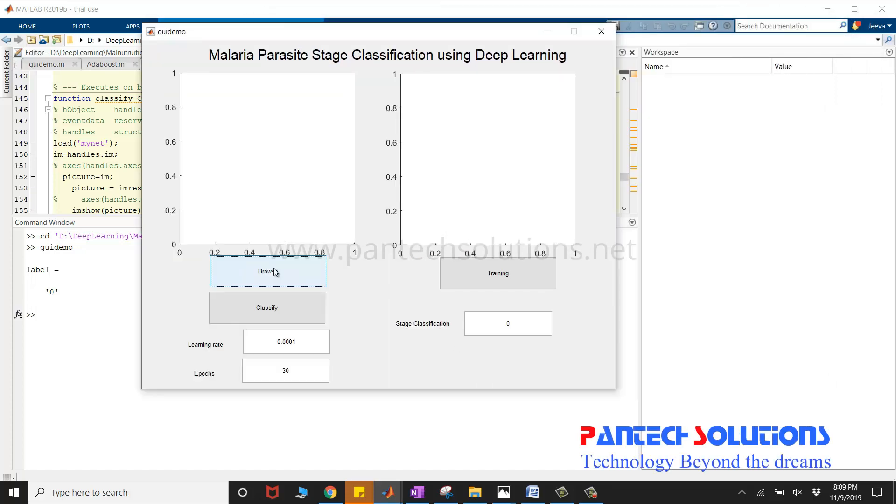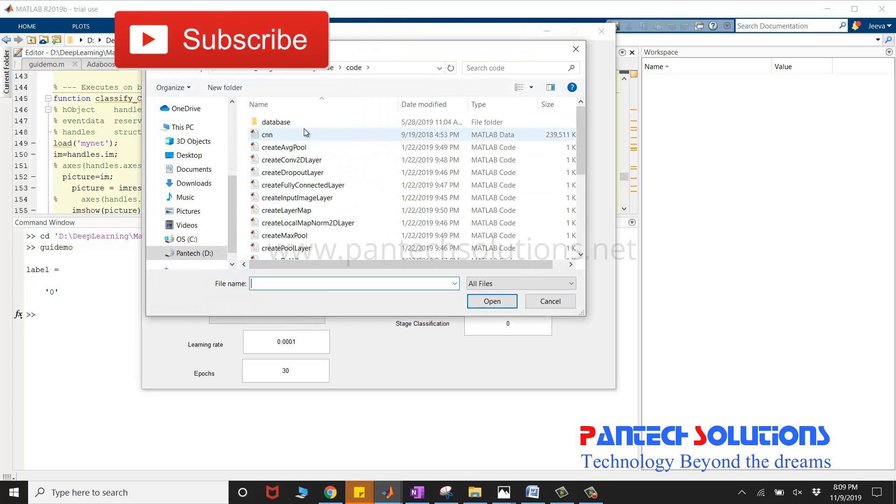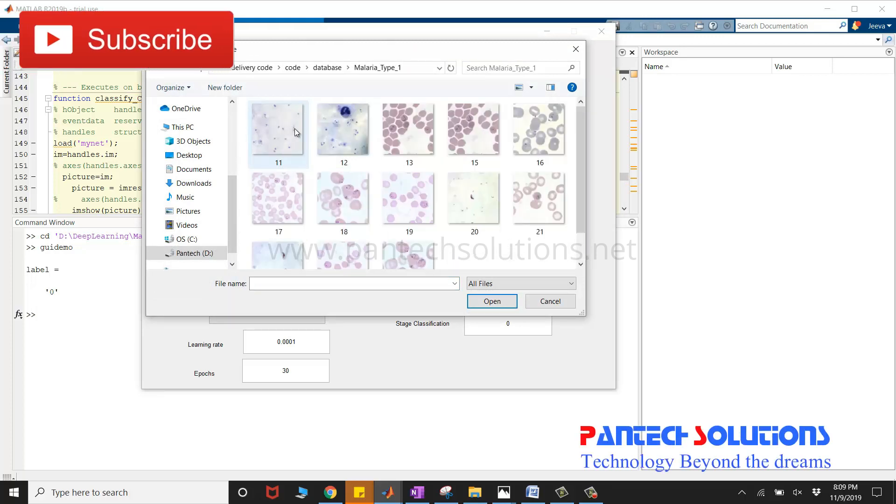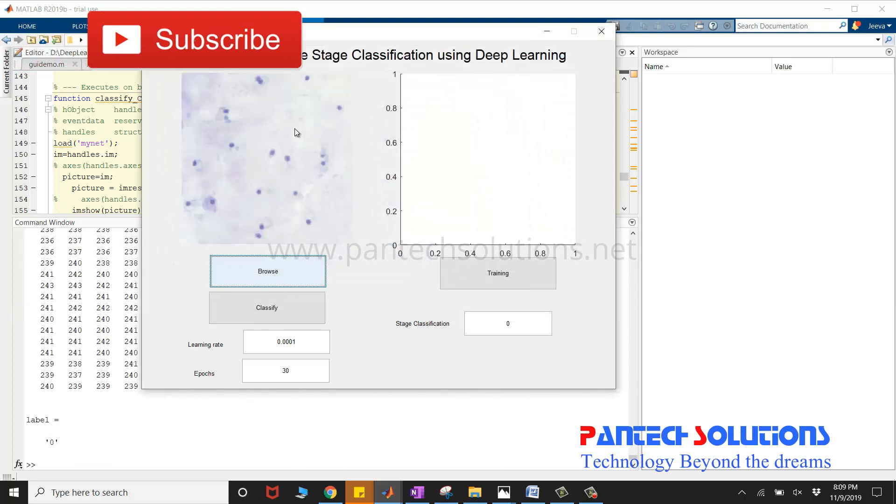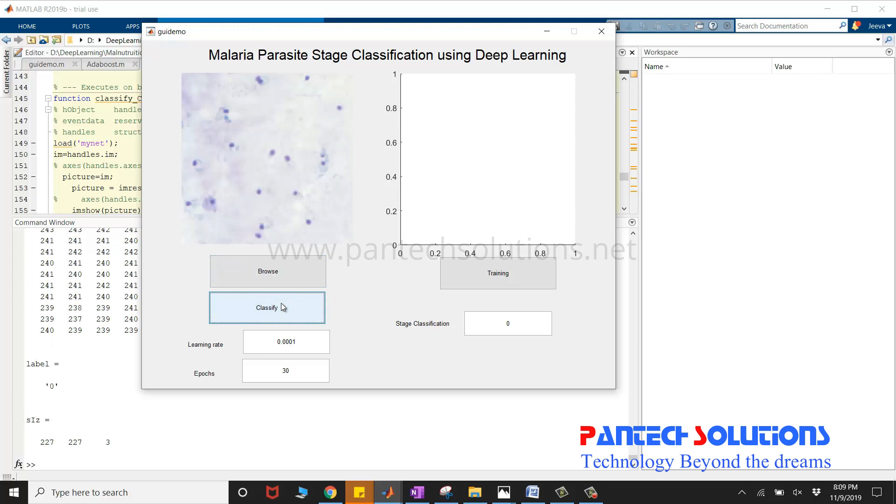Click browse to choose the image, a blood cell which was taken from microscopic images. Click classify to classify the stage.